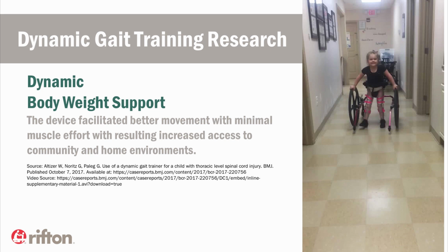This device has pelvic support, which is dynamic in 3 planes, encouraging a typical walking pattern. And they found that it decreased her fatigue and pain. She could now be on her feet for up to an hour, and she participated in a dance class.